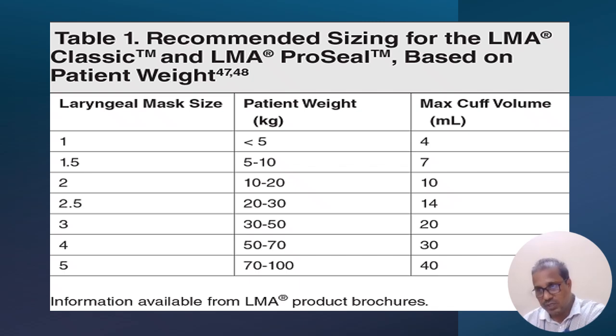The cuff will be positioned at the laryngeal inlet, and when we inflate the cuff, it fully seals the laryngeal inlet. This is the rotational technique.